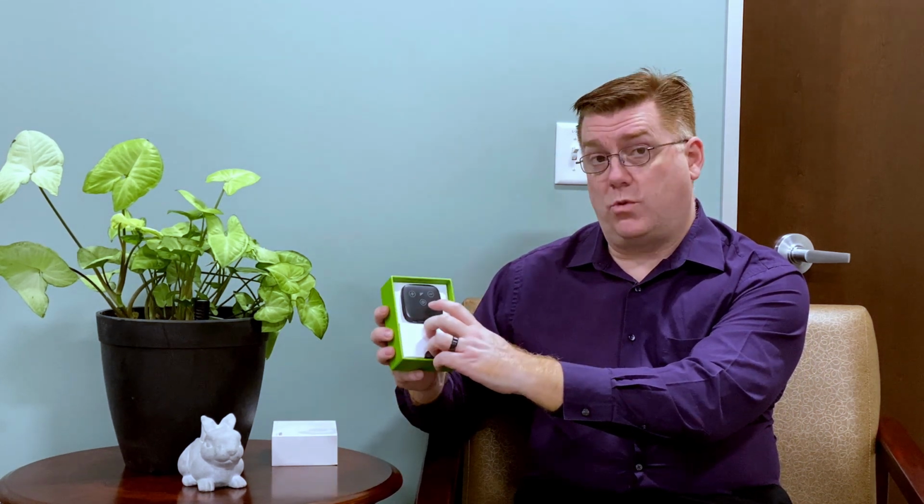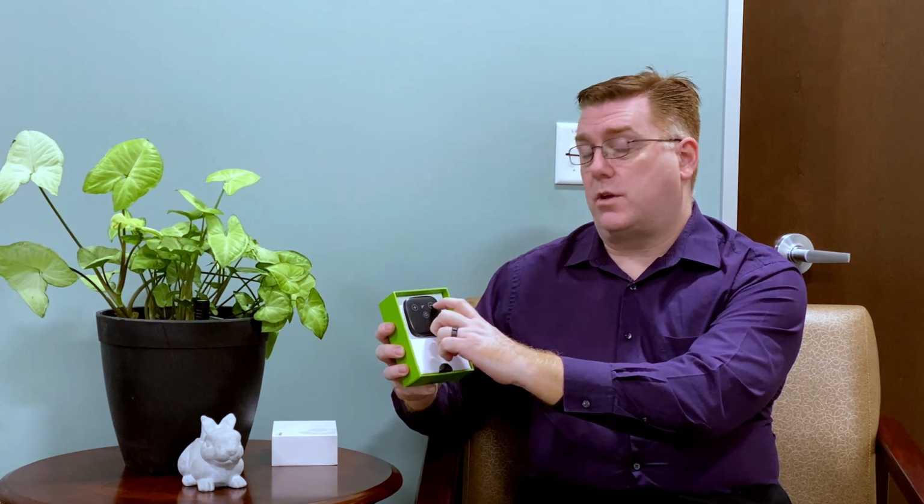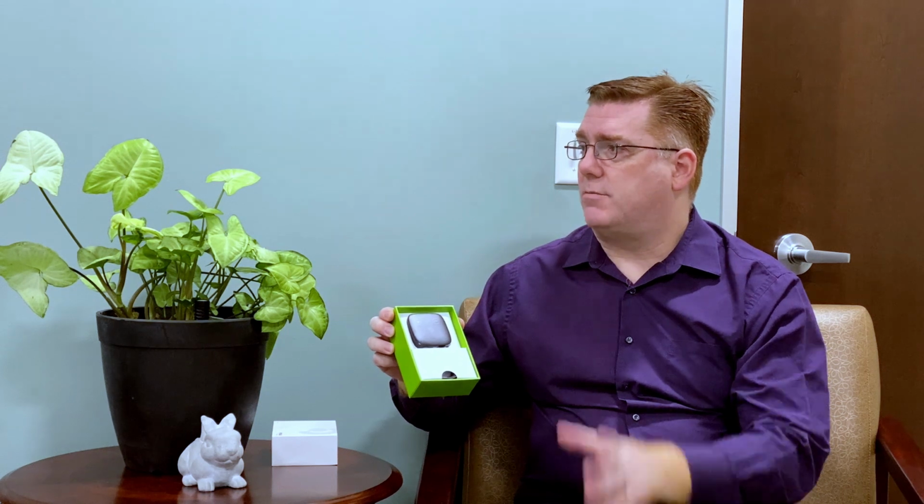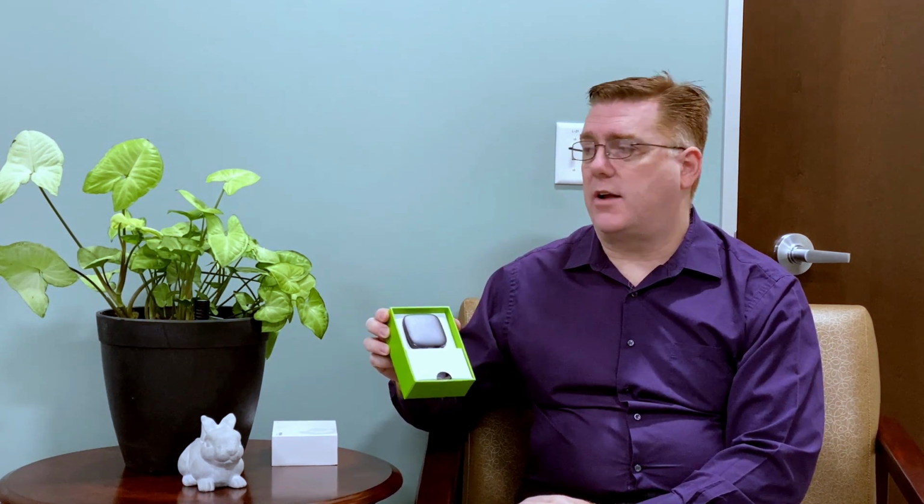One other thing about the TV connector that we did talk about: normally with these, when you first come in, I check to see if there are any problems and do some fine tuning before we come back and interview you. One of the things we found with this is that the volume was a bit too loud when you were first using it, so you had to manually turn things down when you went to the TV connector setting. We went ahead and made that adjustment. One thing to point out is that on the TV connector itself, there is a plus and minus volume. This is good information for people who have one of these devices. You can adjust the volume yourself right here, and it remembers your preference. However, if you adjust this down and it's still too loud, then you'd want to see your audiologist and have them change the setting just for the TV connector to be more in line with your preference.